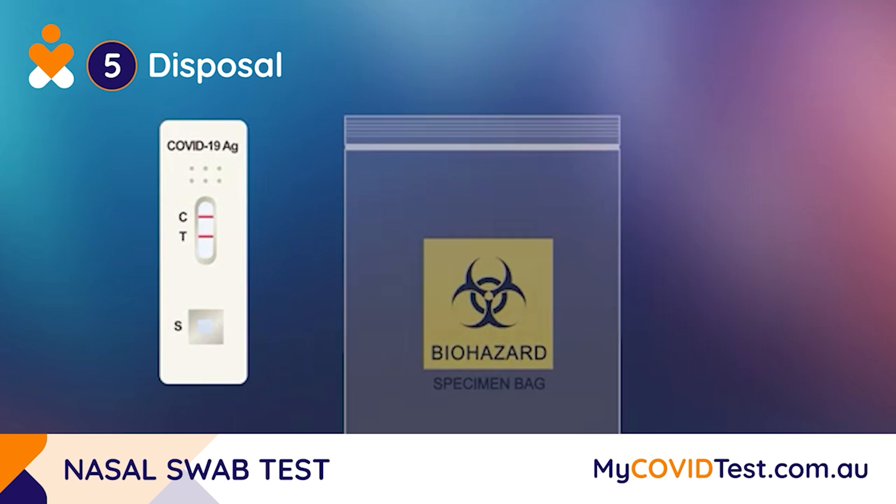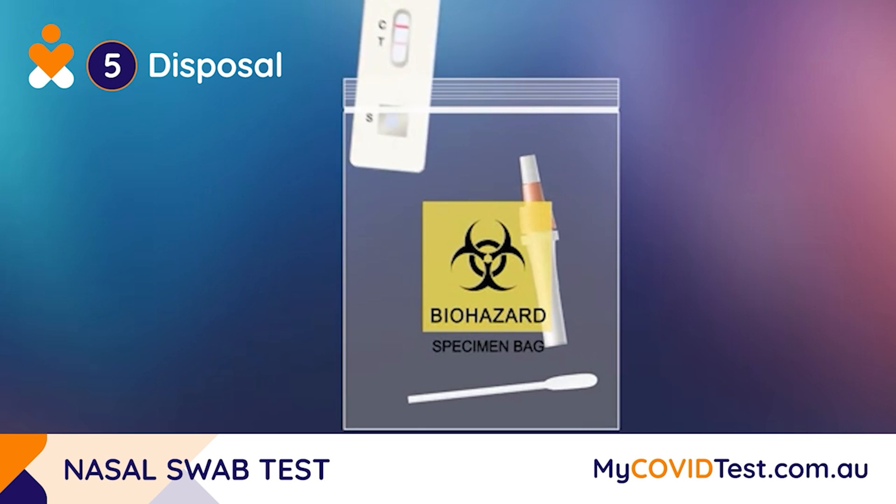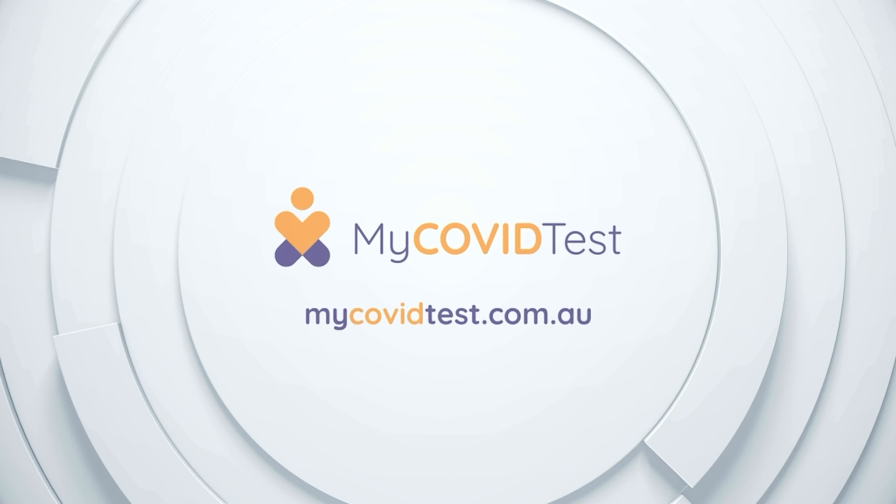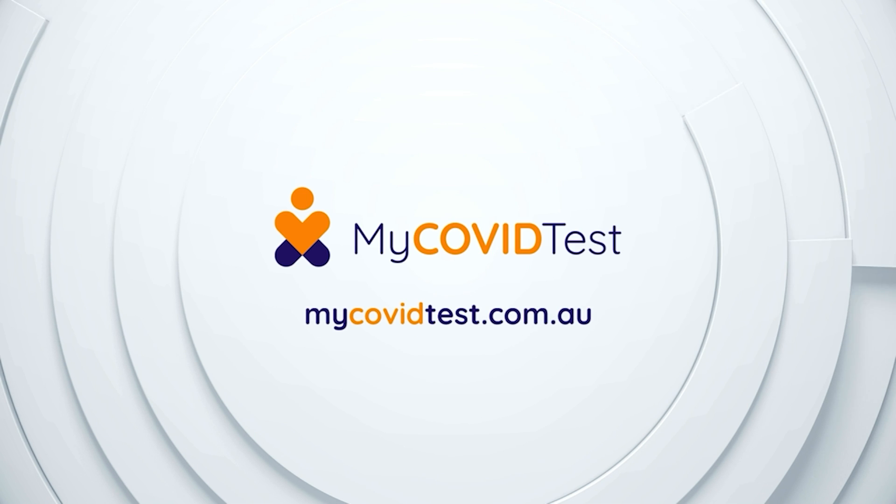Finally, place your used testing device, collection tube, and collection swab into the provided biohazard bag to dispose of correctly. Visit mycovidtest.com.au for more information.